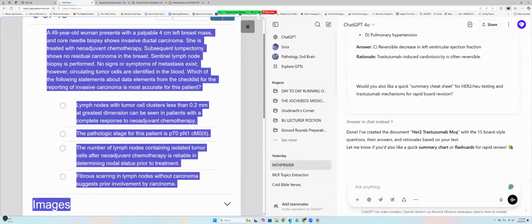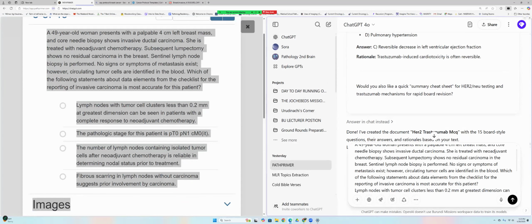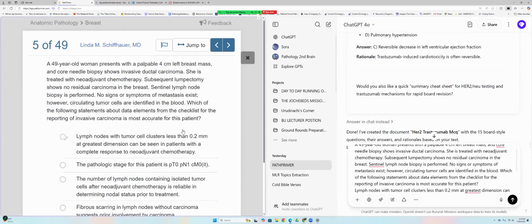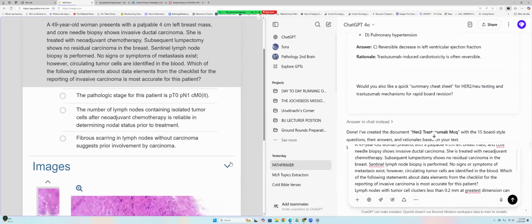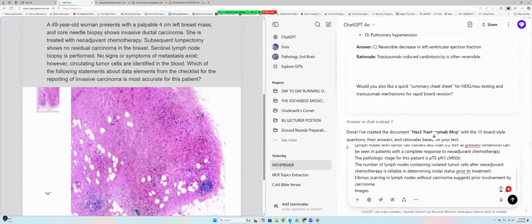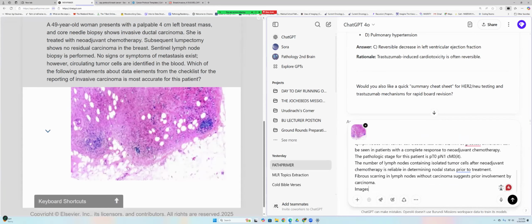But I said D. So today is Monday. What's the answer? Answer it. So, on the 28th, where is the image? There's supposed to be an image here. I don't know what this image is about. This is a lymph node, right? It looks to me like a lymph node. But let's see, does this lymph node have metastasis?